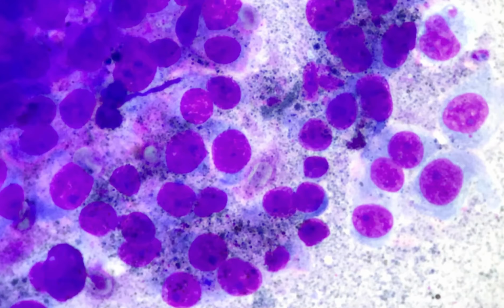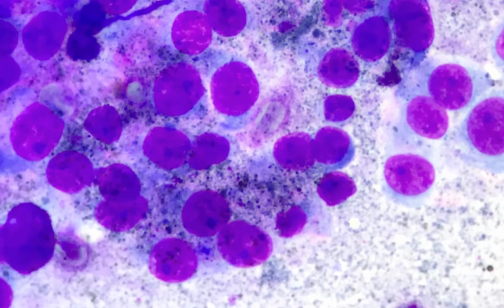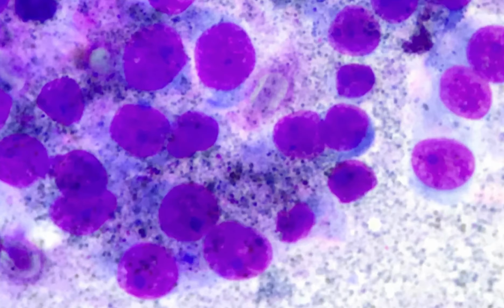And cytologically, you also need to differentiate melanoma from a few things. One is hemosiderophage, because hemosiderin granules can look very similar to melanin granules, and you have to know whether it is a normal melanophage or it is a hemosiderophage.